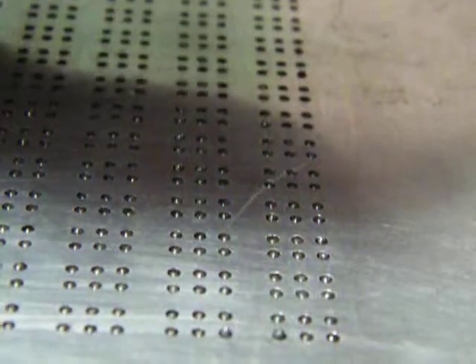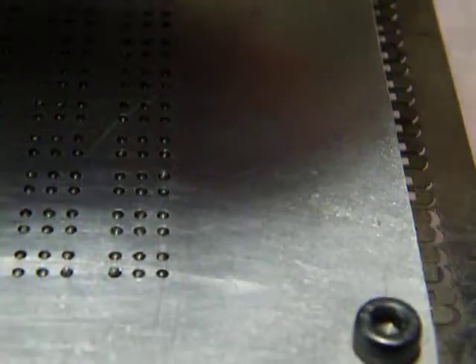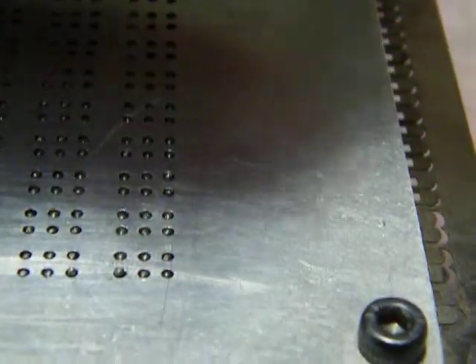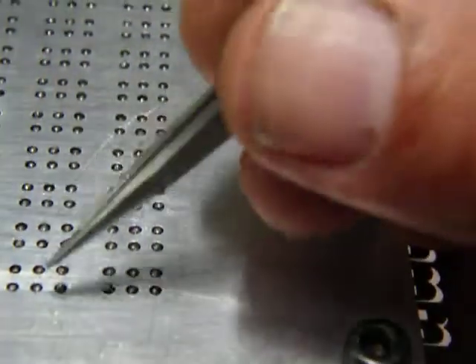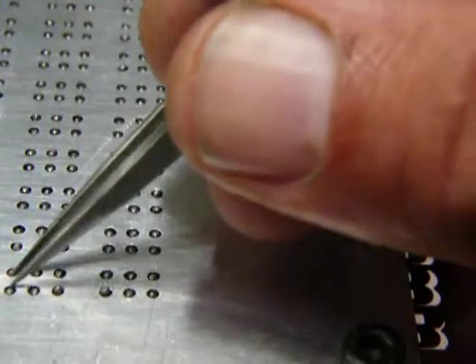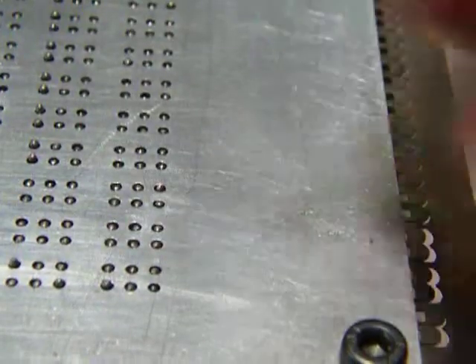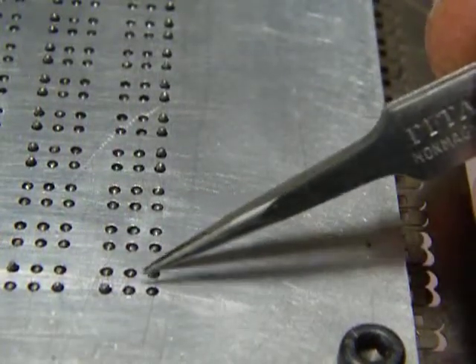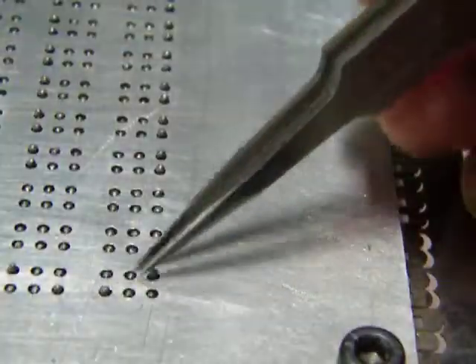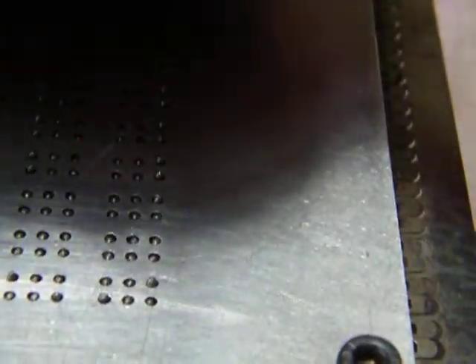So we'll momentarily open the second column. We open the second column over here. This is open. That is, when the gap is shut over at this end, it indicates that it's open. Suppose I want to set this first cell on the second column. I would trigger the first cell on the second column and maybe the last cell and the last column over here on cell 2, or cell 1 rather, the last cell. That's the second column of the first cell here, and here we've got these two pins coming up, and we latch them and release them.